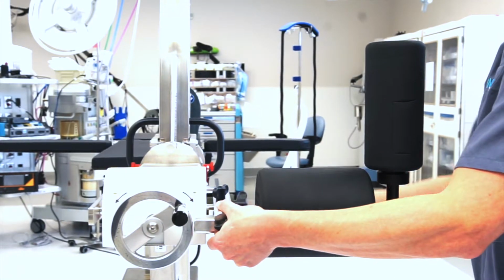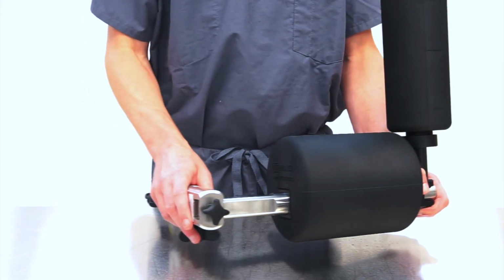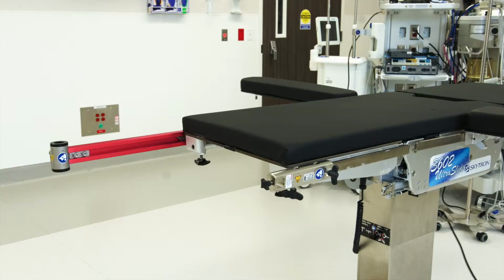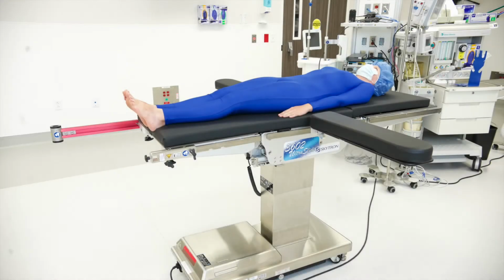Remove the POP from the storage rail. Loosen the star grip knob and remove the adapter rail. Slide the adapter rail onto the operative side OR table side rail. The initial setup for left anterior hip case is now complete. Prep the OR table, then transfer the patient onto the table.